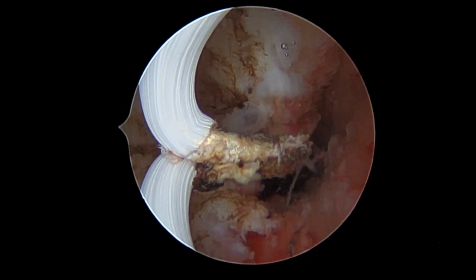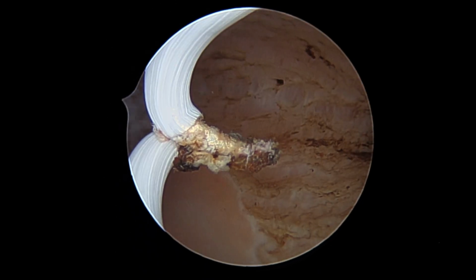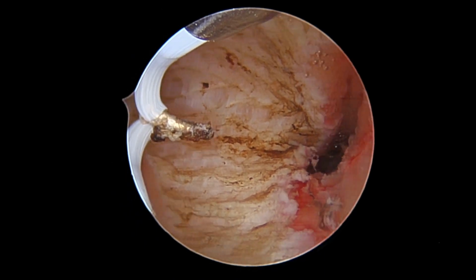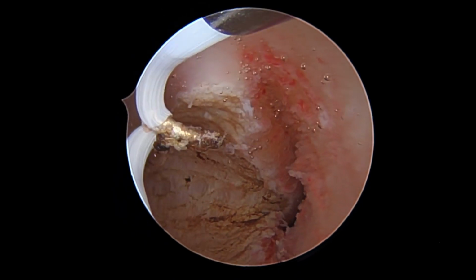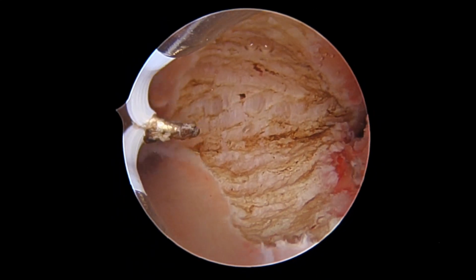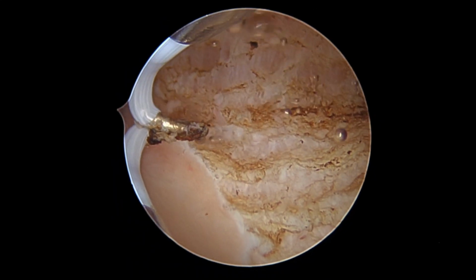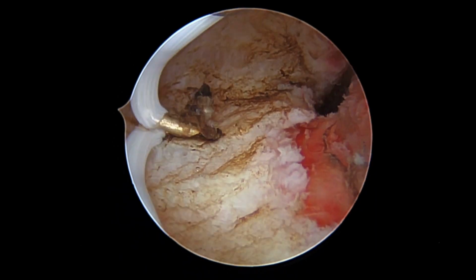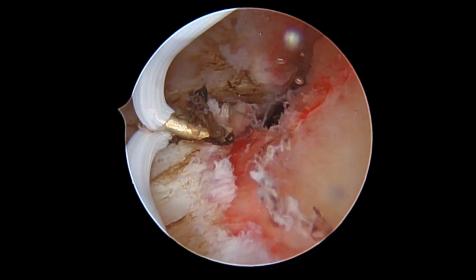One of the risks of this procedure is a uterine perforation and intra-abdominal visceral damage. To avoid this complication, please note the appearance and texture of how the septal tissue and the myometrial tissue differs. Additionally, the anatomical landmarks of the ostia of the fallopian tubes helps orientation.